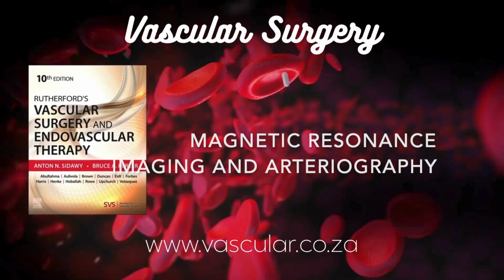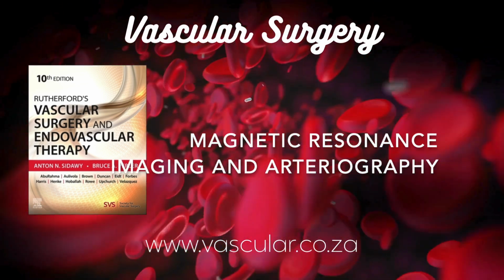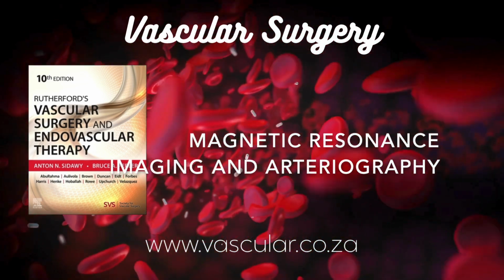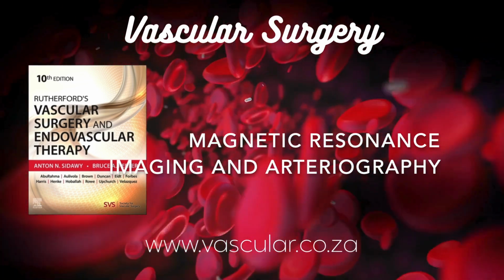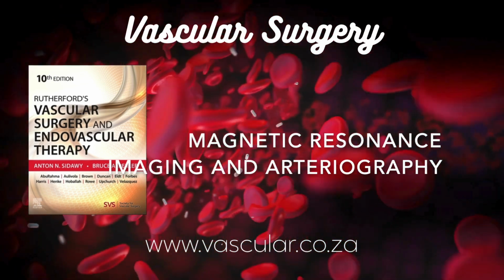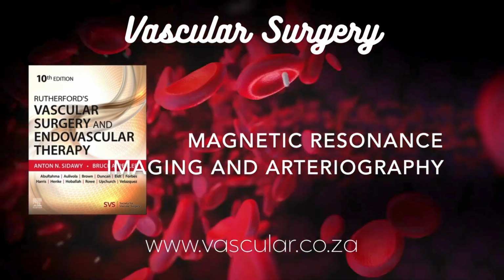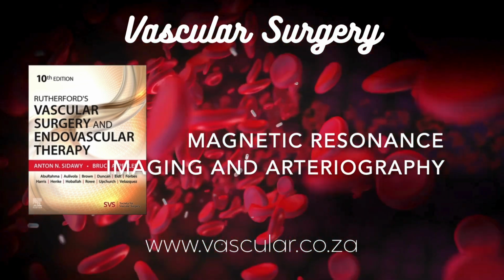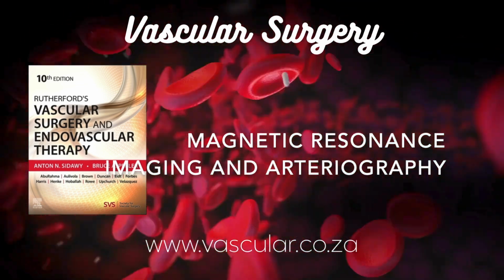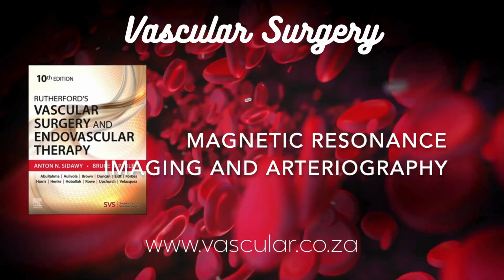Okay, tricky. Another one. Sometimes right when the contrast first hits, especially near the heart or in the subclavian artery, a very high concentration can cause a signal dropout, a dark spot, that mimics a stenosis. This is a susceptibility artifact. Usually, imaging again quickly as the contrast dilutes fixes it. What about metal? Big issue. Metal implants, stents, clips, joint replacements cause significant signal voids and distortions. There are special sequences like MAVRIC or SEMAC designed to reduce these artifacts, but they don't eliminate them completely. Metal can really obscure nearby vessels.